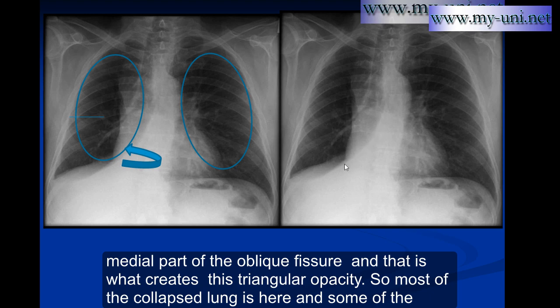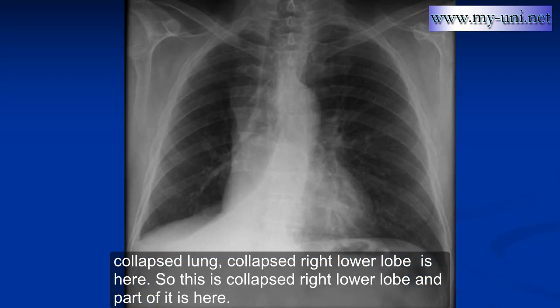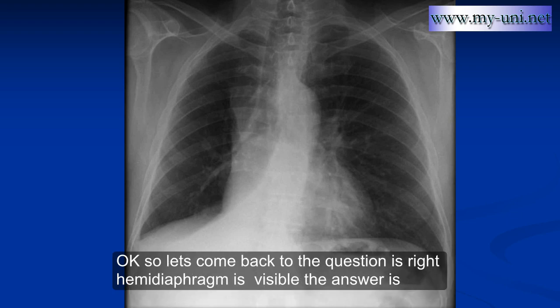Most of the collapsed lung is here, and some collapsed lung is here. This is the collapsed right lower lobe. This is the superior vena cava, and some part of the right heart border is here. Let's come back to the question: is the right hemidiaphragm really visible? The answer is no.